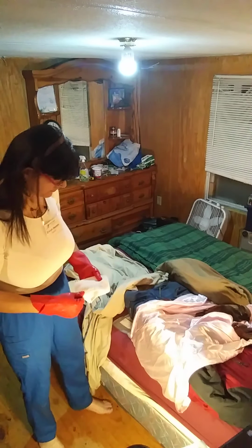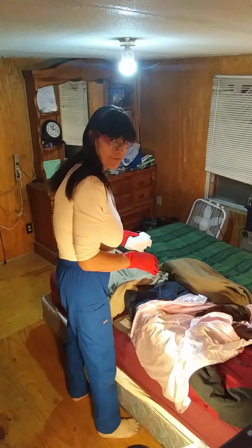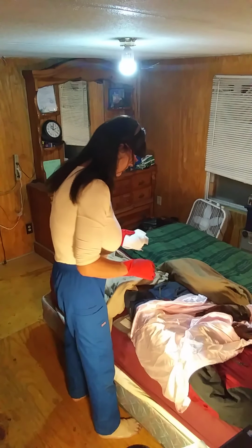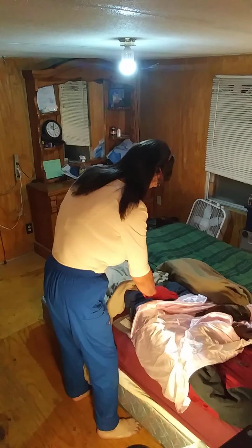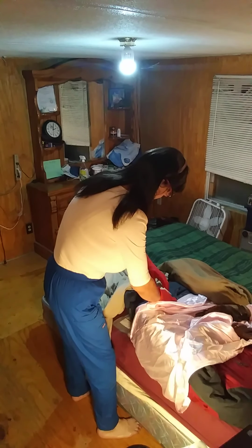I'm going to clean her catheter 3 times. What I'm going to do is I'm going to grab the catheter. I'm going to hold the catheter right above the meatus where it comes out without tugging on the catheter. I'm just going to hold it right above the meatus, as close to the meatus as possible. And then I'm going to wrap the washcloth around it.